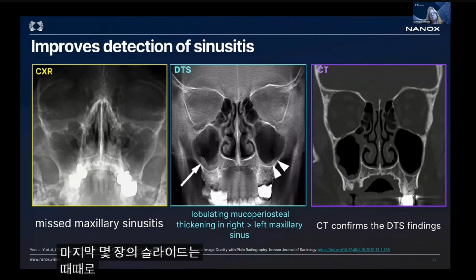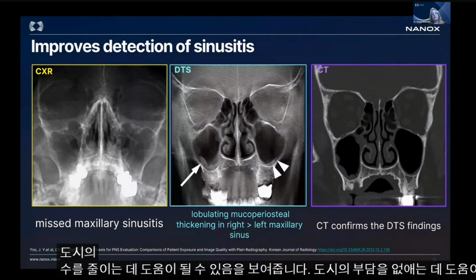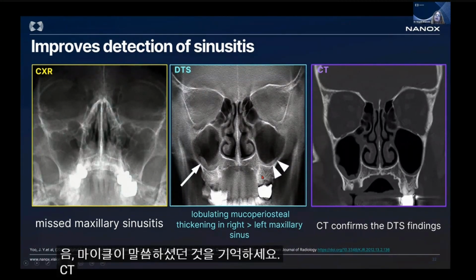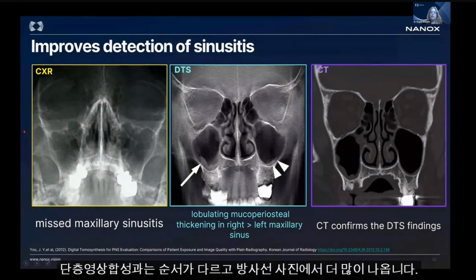I think these several examples that I showed you in the last several slides really show you that sometimes it can help eliminate the number of CTs, eliminate the burden on CTs. And it may be very important because, remember, I'm sure Michael Hughes told you that the amount of radiation in CT is in a different order than in tomosynthesis, and even more so compared to radiographs.